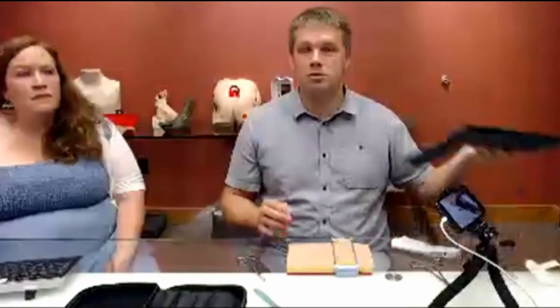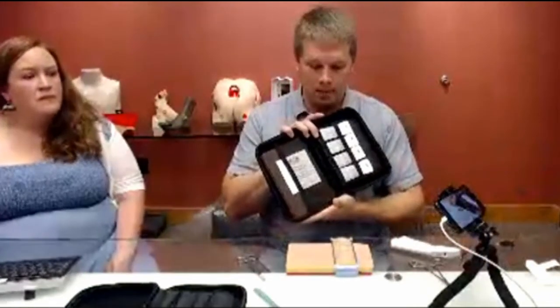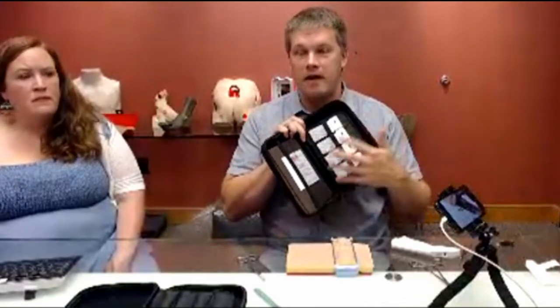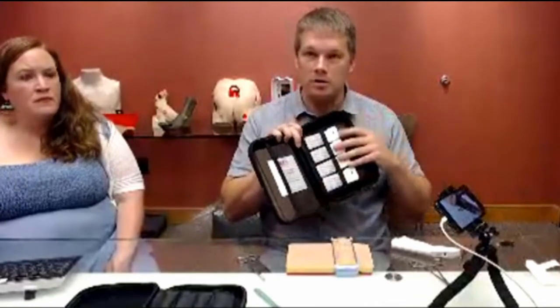Like I said at the beginning, the pad also comes in the darker skin — that's going to have the same five layers: dermis, epidermis, fat, fascia, and muscle, and then all the same supplies in this one as well. We do sell the products individually, so some people who already have instruments they like or already have sutures will buy just the pad and the tension device for their needs.